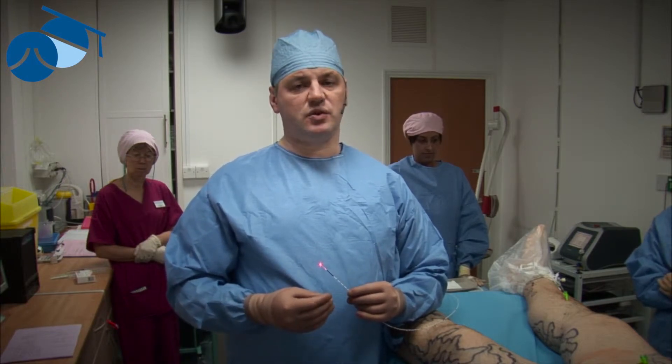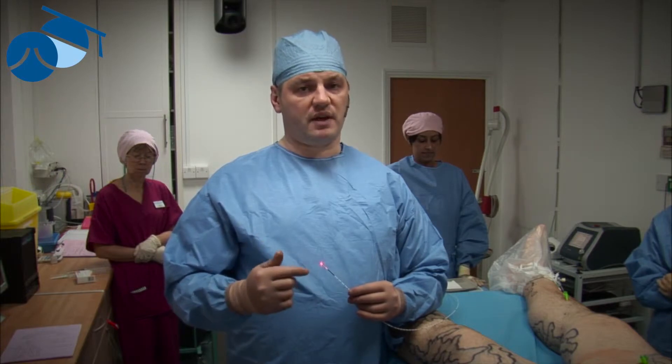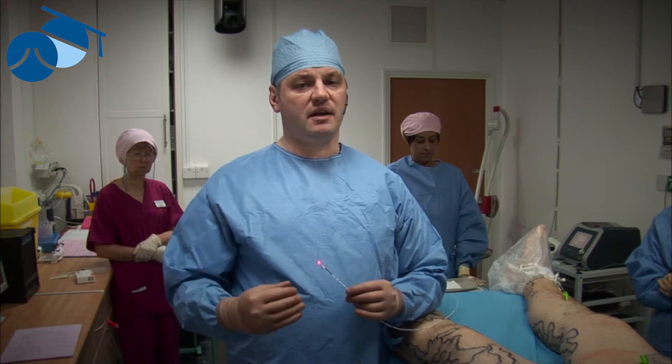The endovenous techniques cause the vein wall — provided it's used correctly at the right power and the right pullback — to shrivel away, completely die, and the patient's body eats that away itself.